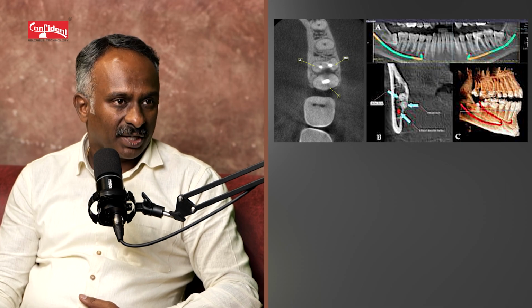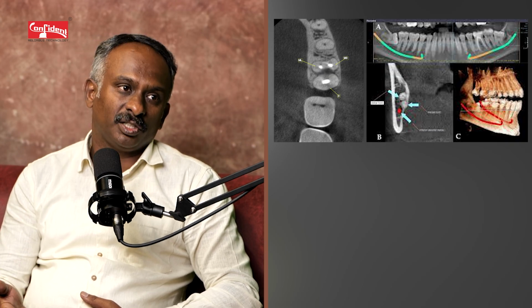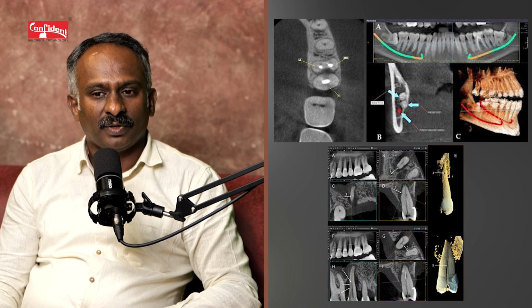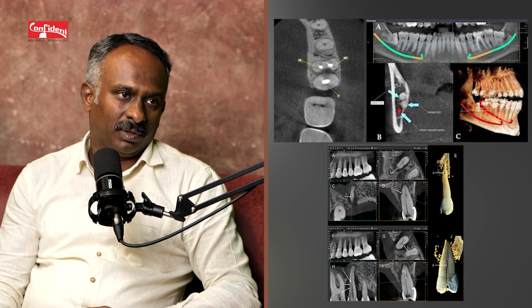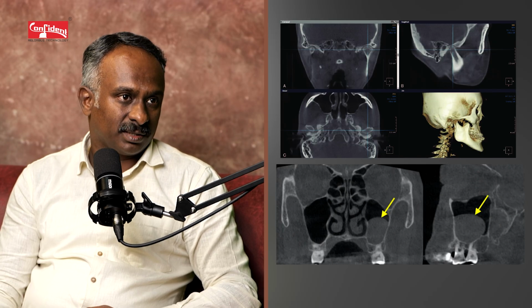See, the indications usually stay basically as for a panoramic radiograph, but whenever we want in-depth analysis, like assessment of the number of canals, what to see in a canal, or disimpaction, assessment of the inferior alveolar nerve canal in relation to the periapex of third molars or the molars, fracture assessment, be it dental or alveolar, dento-alveolar component, assessment of temporomandibular condyles, then assessment of maxillary sinusitis, because that also plays an essential role.